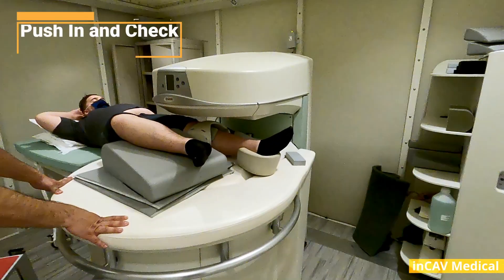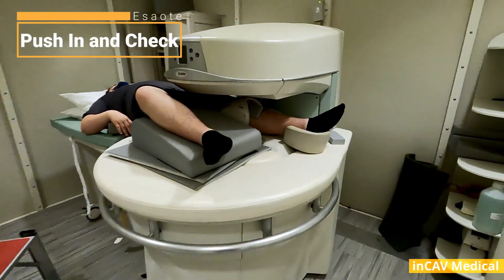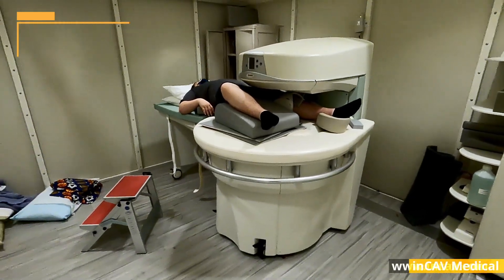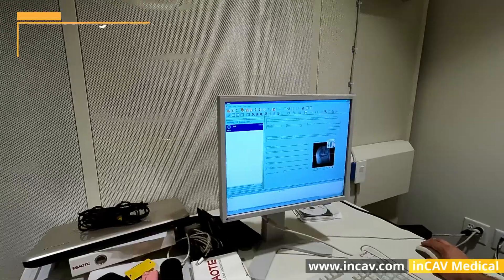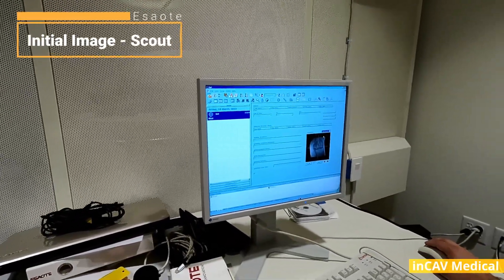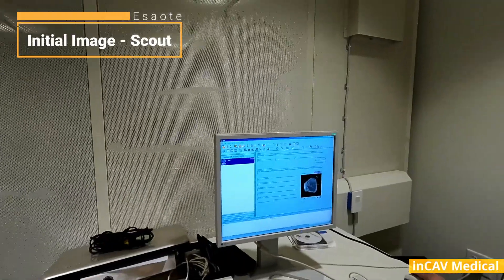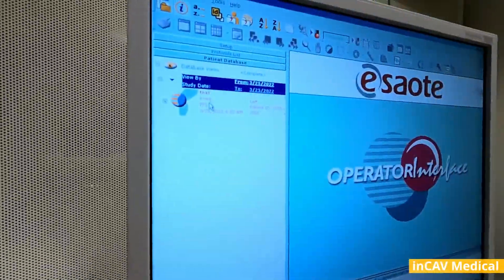When the patient is ready, we will push into the MRI and do the last check on the positioning and leave the room, closing the cage. On the workstation, the first step is to get the scout image or initial image. Here is when we check we have the right alignment.